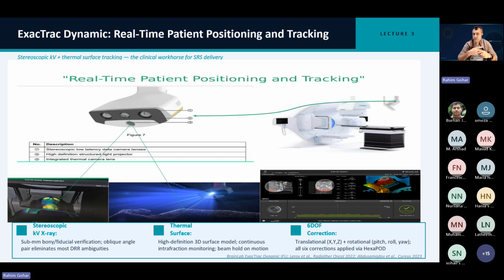If you don't have this set of imaging, then if you do a cone beam CT at couch 0, run the first arc, and then give a kick, that sort of displacement, the mechanical runout inherently in the system, there is no way that you can do the correction, right? Because the XVI is not going to work once you give a kick. And we have seen that in the first part of the lecture.